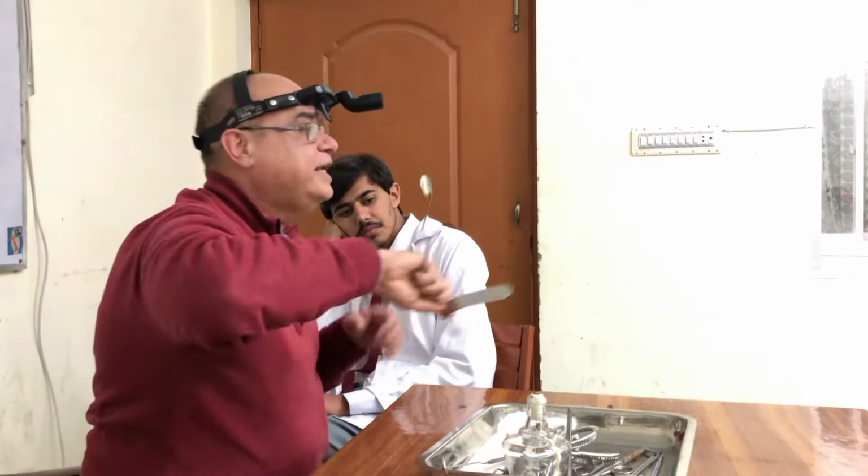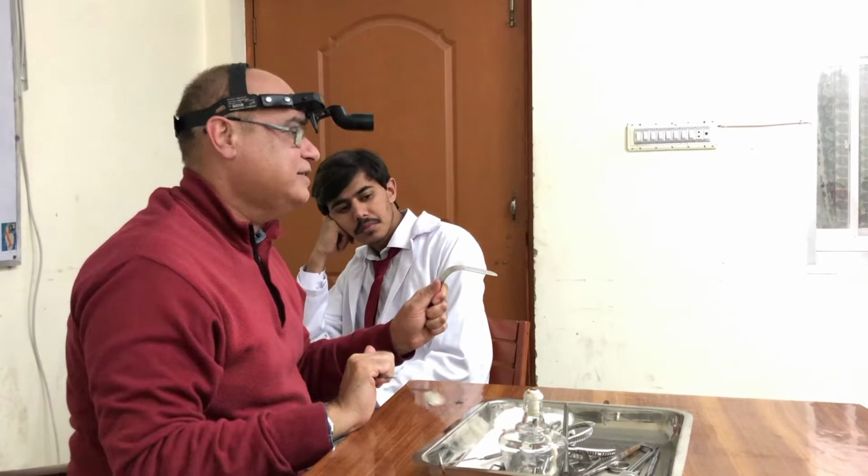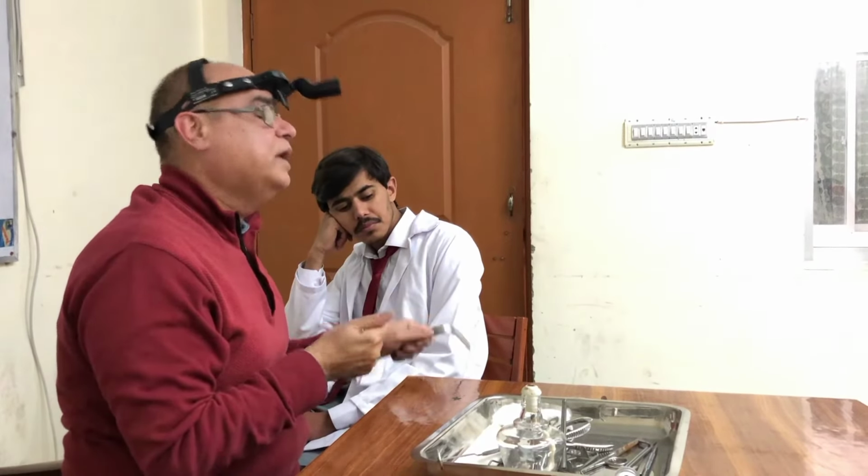So what you have to do is check it from the metal side on the back of your hand, that it is comfortable for the body or the tissue. It should not be overheated. Once you have done that, you will take this metallic tongue depressor, warmed and checked.